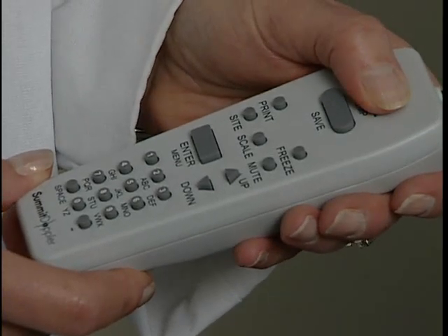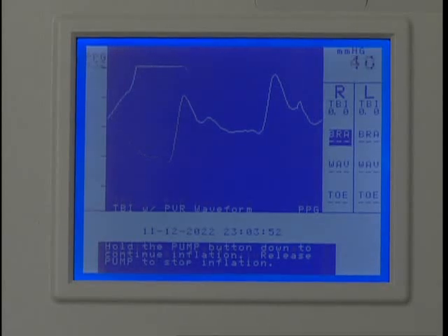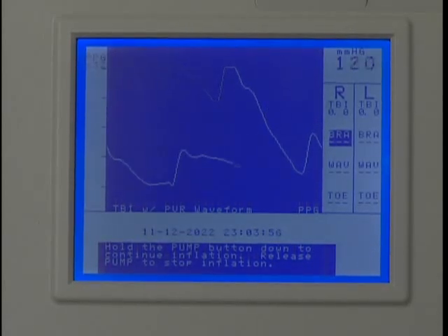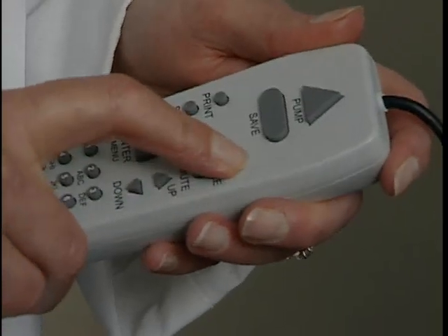Once stable, press Pump to inflate the cuff. Continue to inflate to a pressure approximately 20 millimeters of mercury above the pressure where the PPG pulsations disappear. The cuff will begin to deflate automatically once the pump stops. Press Freeze after several pulses have reappeared.